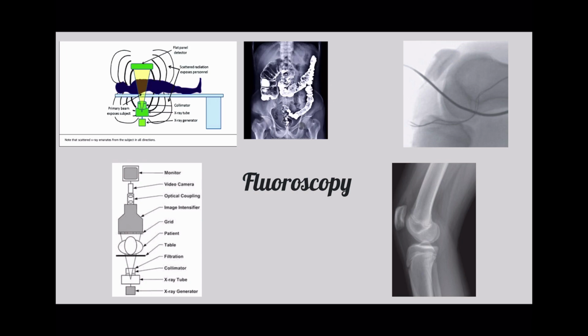As previously mentioned, fluoroscopy plays a key role in the medical field, especially that of imaging. This is due to its ability to produce X-rays and continuously allow us to see a projection in real time. Similar to that of a movie scene, fluoroscopy gives us a proper radiograph of specific body parts via radiation. Due to its reliability, it is often used as a guide in medical procedures, such as inserting a catheter into the body and up into the heart.